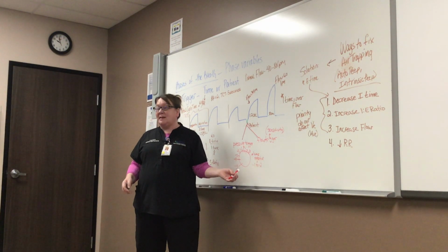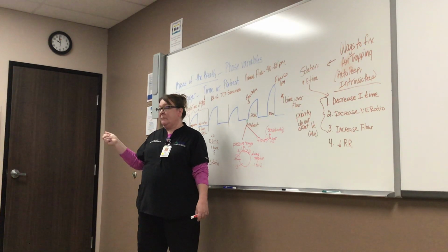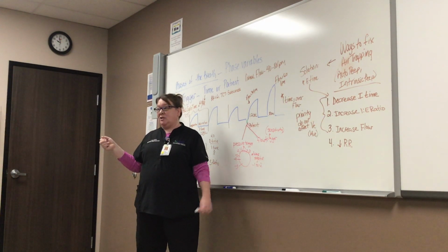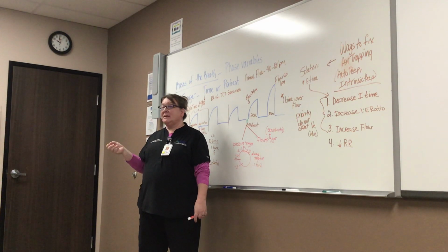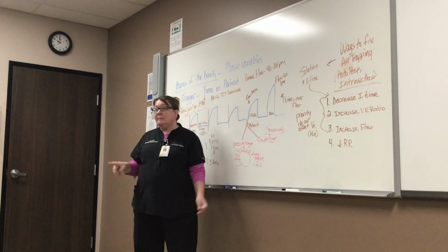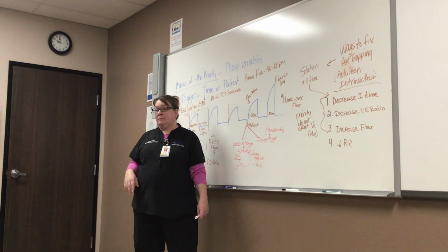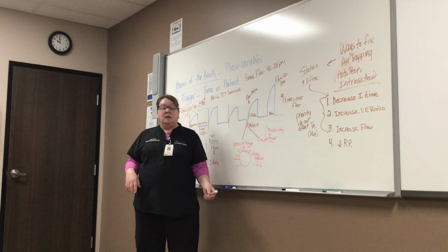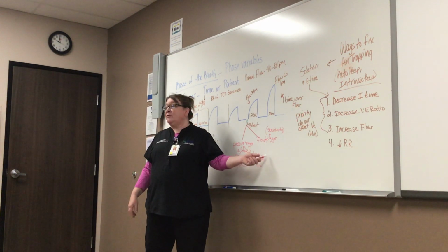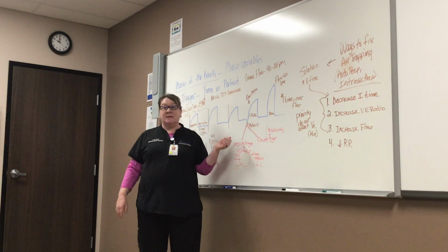So in the lab setting, you're going to turn it to -10, but never on a real patient. And if you turn it to -10 in the lab, it'll stop doing that and give you the actual breath that you want. But for real people, -2 is actually a really perfect number. And when I describe flow trigger, which I will in a minute, I will tell you that pressure trigger is not favored.